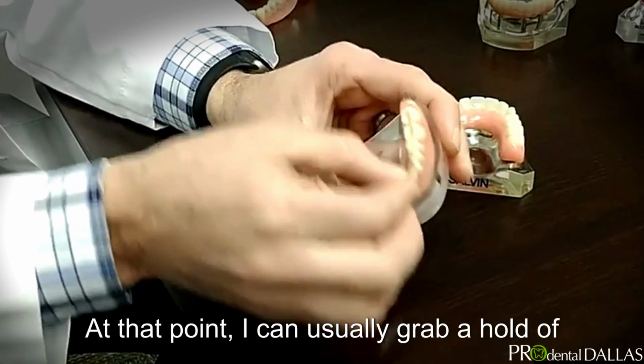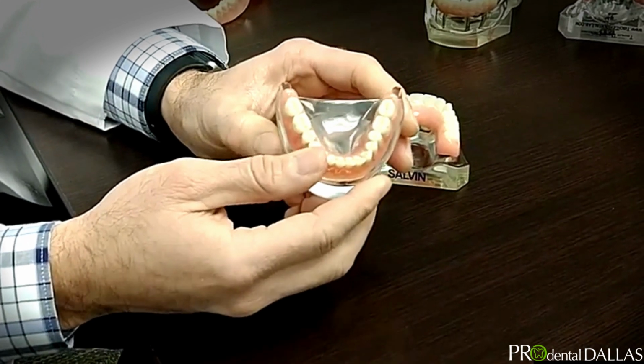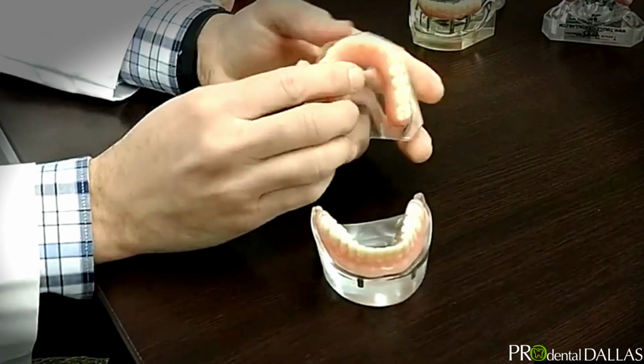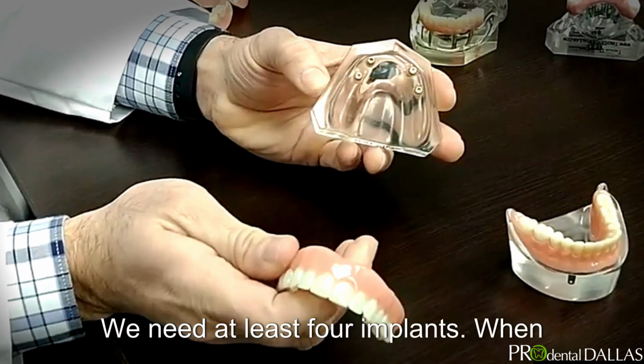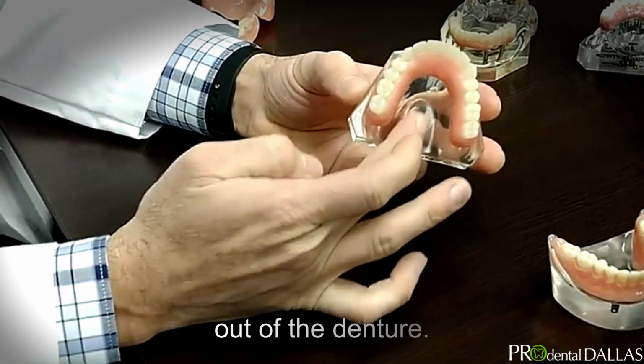At that point, I can usually grab a hold of the denture and wiggle, and it doesn't move. It's stuck in the patient's mouth. For a maxillary overdenture, the difference is gravity works against us, and we need more than 2 implants. We need at least 4 implants. When we have 4 implants, we can take the palate out of the denture.